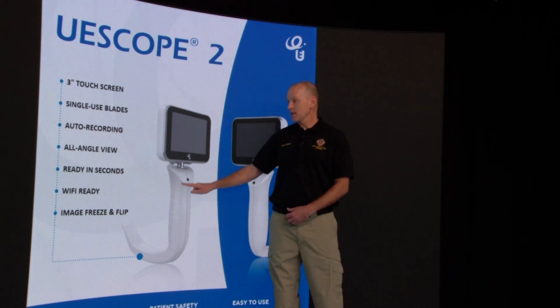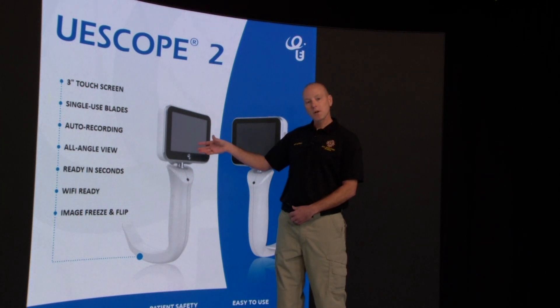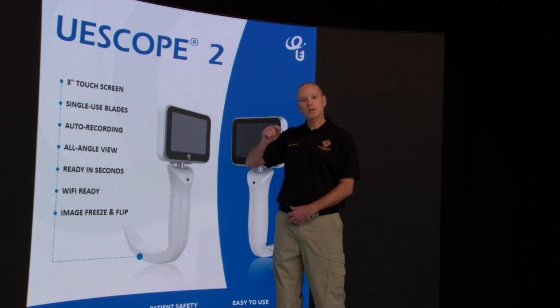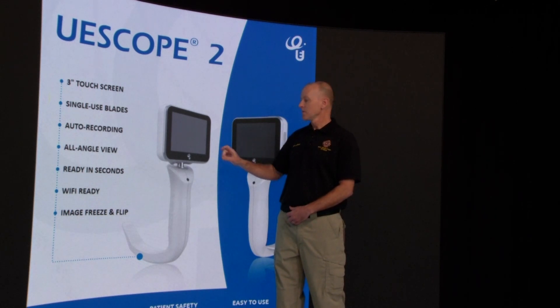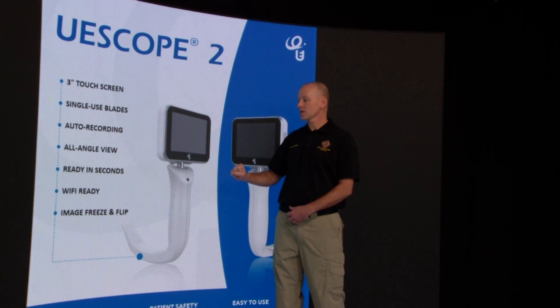Each of them has a single-use blade. We'll also be able to do screen mirroring, so if you're doing a face-to-face intubation, the screen will actually invert itself so you can see face-to-face. Once you connect it and turn the power on, it's actually ready to go in a few seconds.